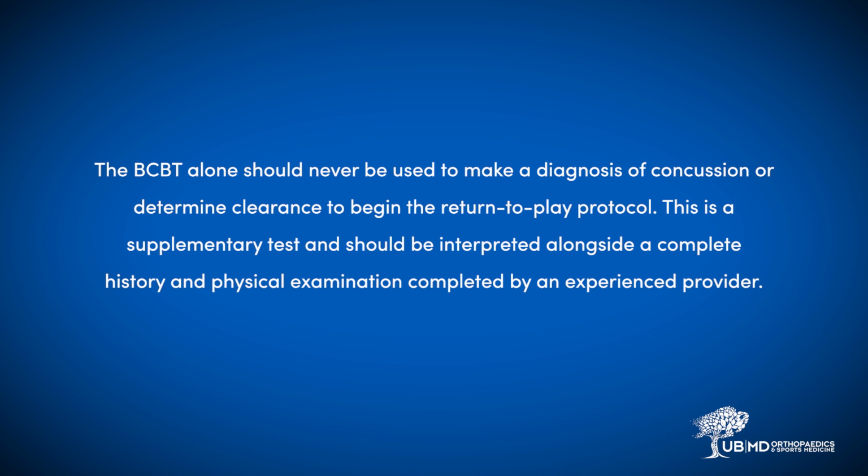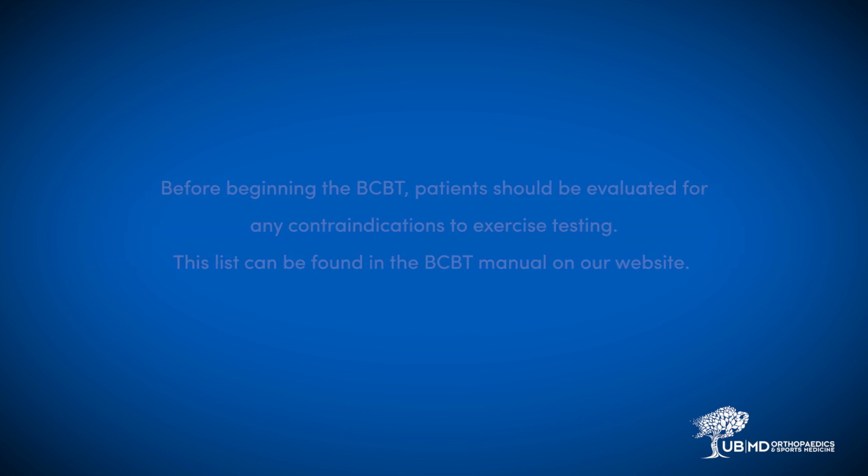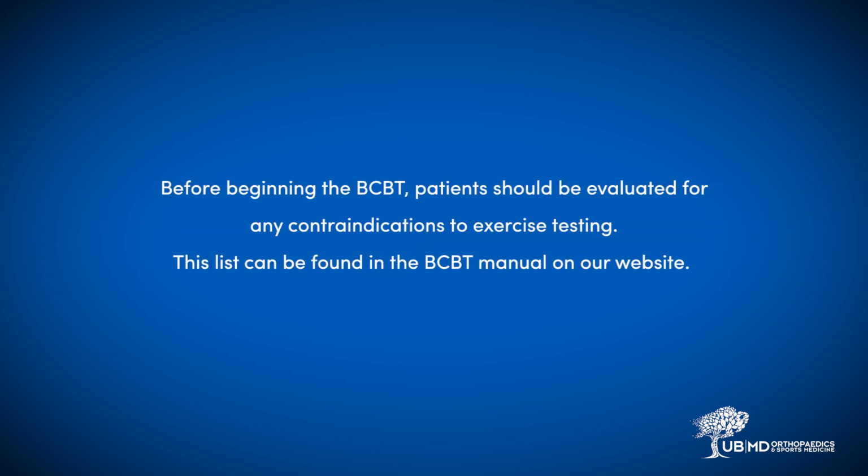Unlike the treadmill exercise tests, the BCBT is completed while in a seated position. Therefore, this test is reasonable for patients with significant vestibular or balance problems that prevent them from walking safely on a treadmill. Before beginning the BCBT, patients should be evaluated for any contraindications to exercise testing. This list can be found in the BCBT manual on our website.